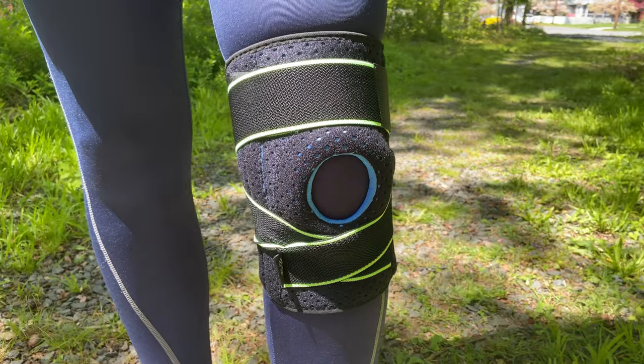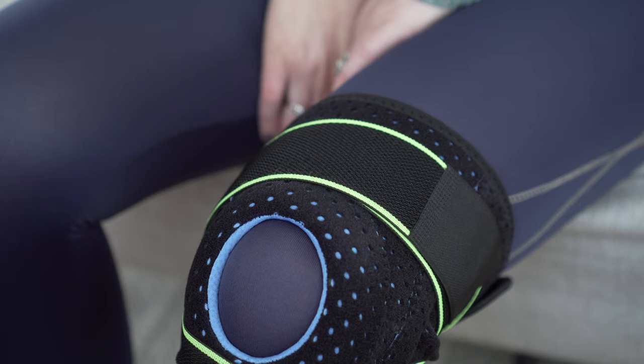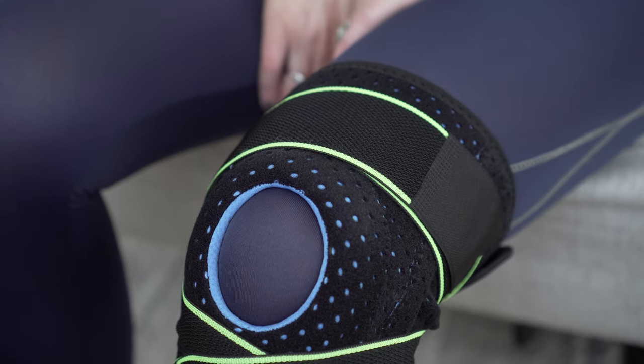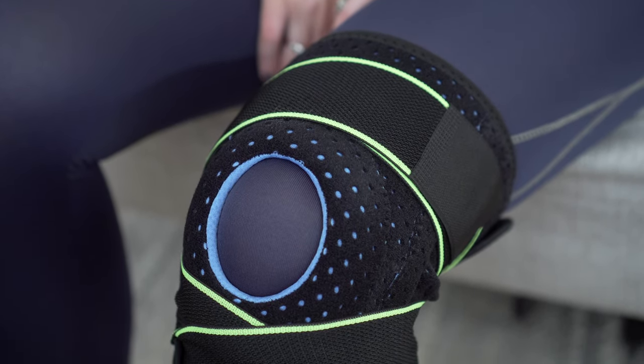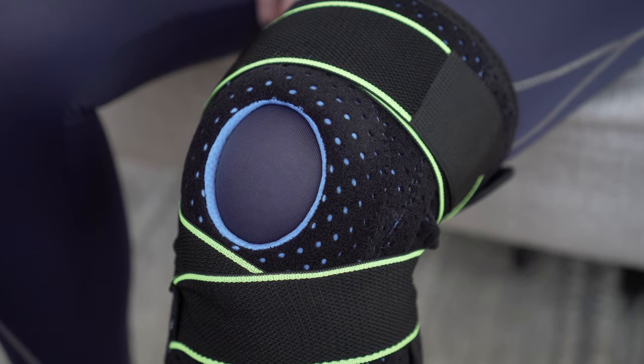Hey guys, today I want to share with you the Body Prox knee brace. If you are suffering from acute or chronic knee pain, this is going to be the product that helps you get back on track. You are going to begin to feel a difference on your knee in no time. There are so many different things to love about this specific knee brace with breathable neoprene, but there are four main things that are just going to make you run out and grab this for yourself.